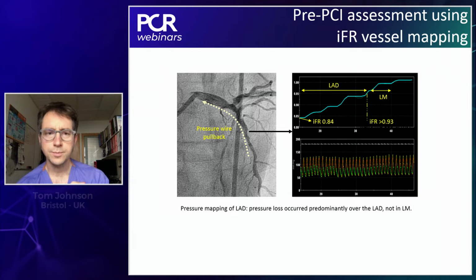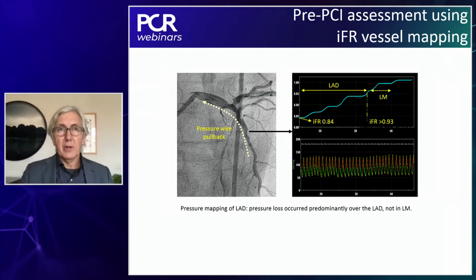Well, personally, now you have a lot of availability of non-hyperemic indexes. Personally, I believe that you have less chances of crosstalk between distal stenosis and left main stenosis if you're using a resting index. And the example I showed you before was a good example, that if you're performing a pullback with FFR, you will be fooled about the significance of the left main stenosis by the distal disease, because in a way that is what happens.